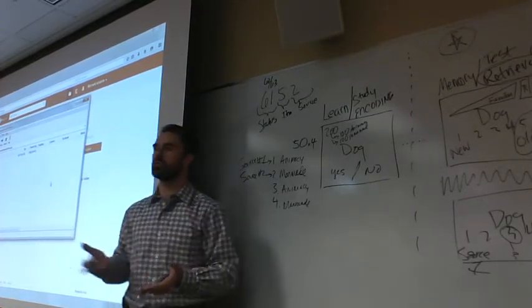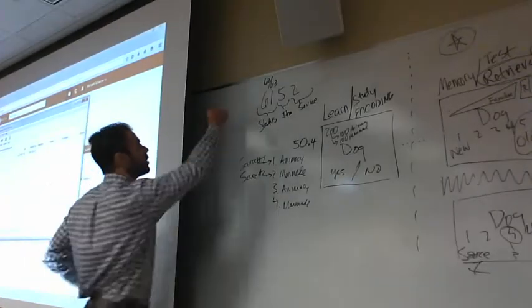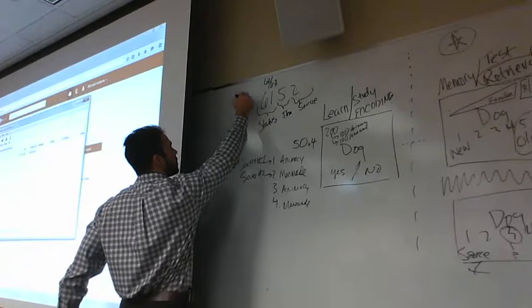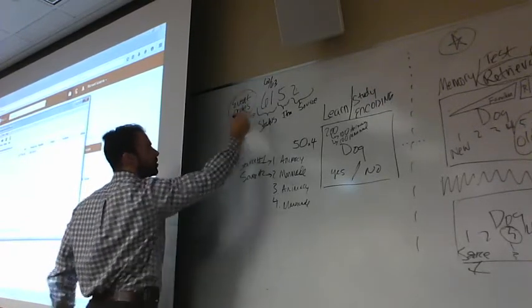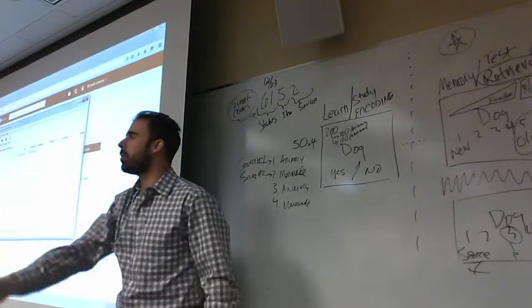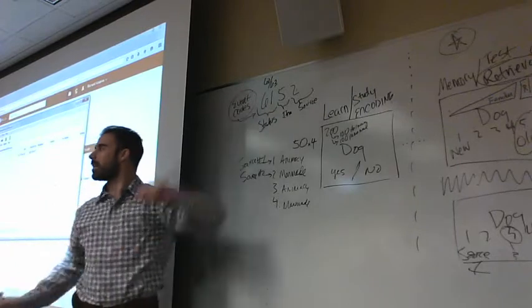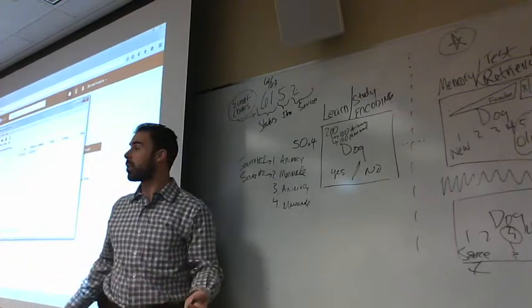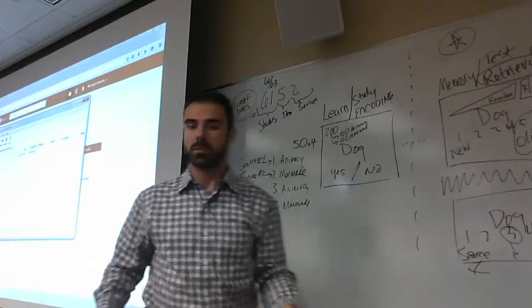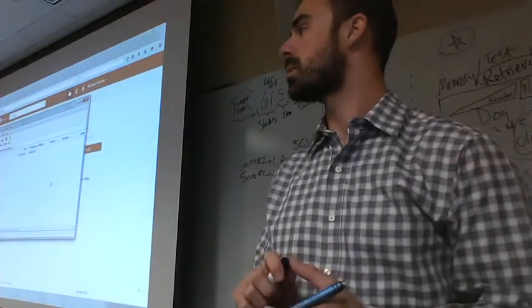So that's a little introduction to what we're going to call here, these are our event codes. And you guys remember when we looked at the EEG, we saw that vertical line with all of our event codes in it. That's what they are. That's what they mean. And that's why they're really important and really useful for our purposes. Make sense? Any questions? Yes, ma'am.